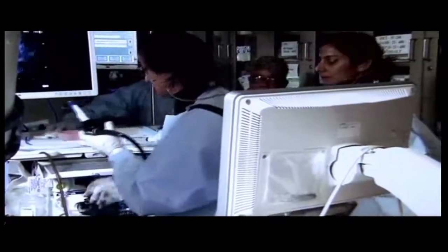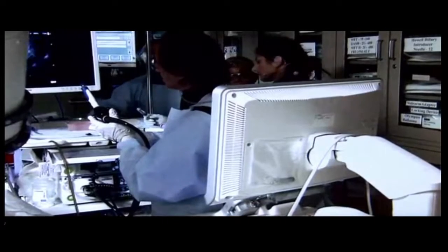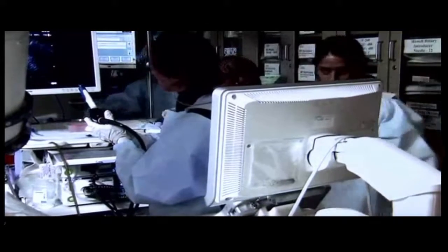You can see the PD again. Put her on her back more? Yeah, and we can actually start to put her on her back now. So we're going to turn her a bit on her back, and we'll also get the floor into view.